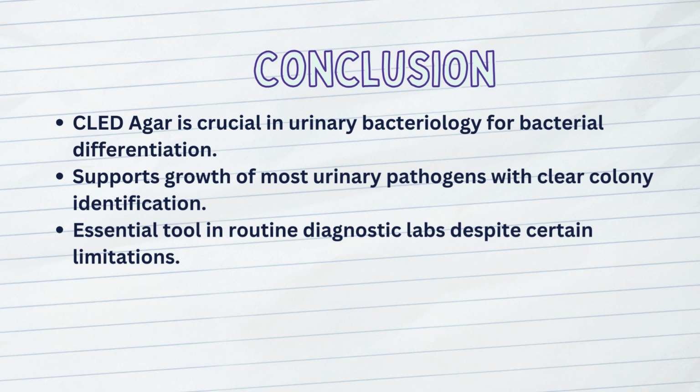It also helps us when it comes to quantification of the bacteria itself. So, while it's not perfect and has its limitations, the advantages it offers in routine diagnostic work make it a staple in microbiology labs worldwide.